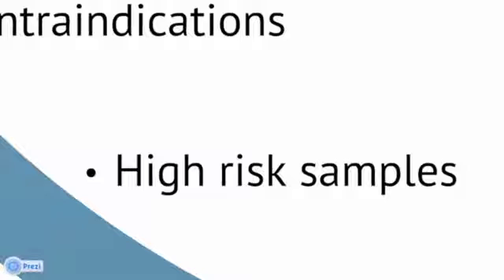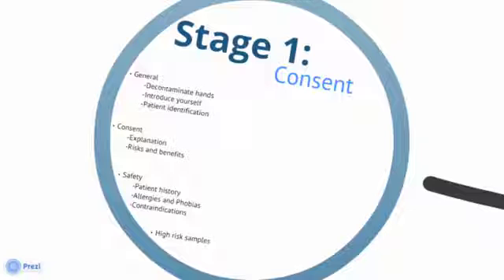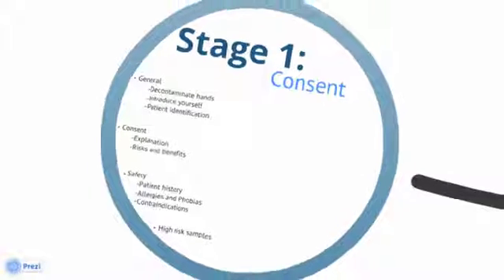With blood cultures, it is imperative to check the patient travel history within the last 3 months and inquire about certain blood-borne infections, as these may be deemed high-risk samples. More information on this section can be found in the workbook accompanying this video or in the UHL blood culture taking policy.